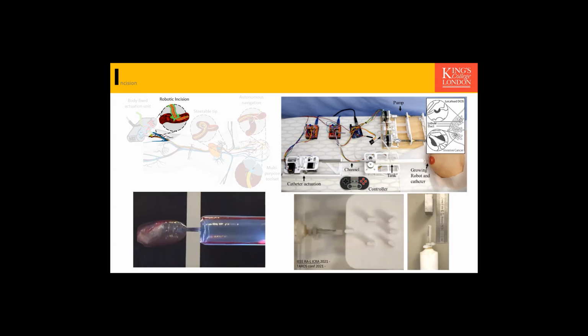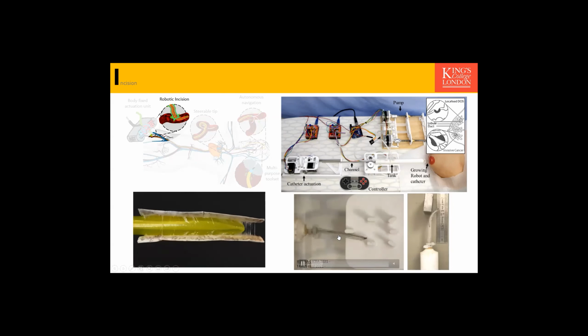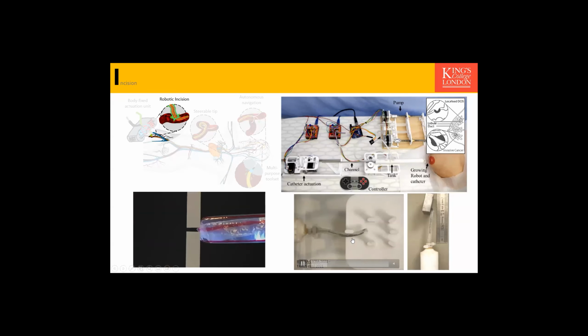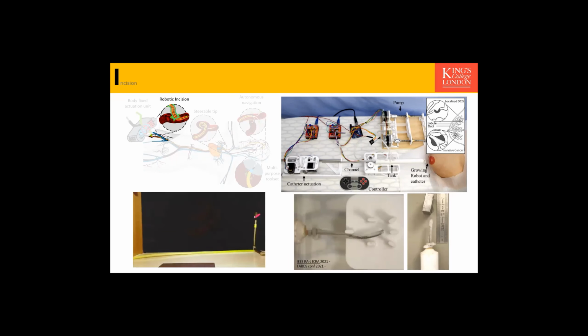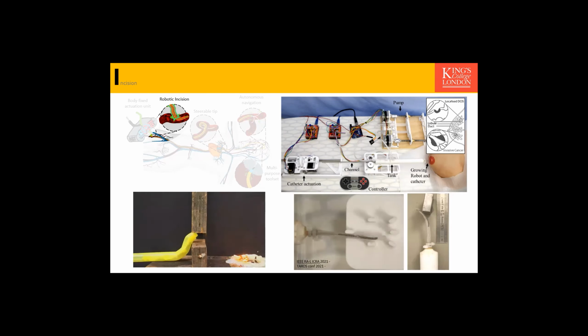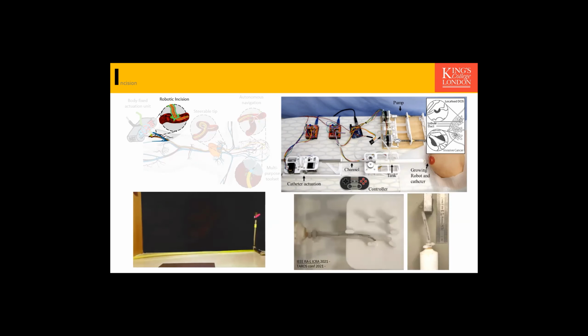Being miniature, we had a lot of issues for effective growing of the robot. You see the inner catheter, which is a tendon-driven catheter, needs to push in and out to promote the growth of the sheath. But overall, we have effective growth and steering. Fantastic job by Pierre. He has a company in France at the moment pursuing the same idea, and we have talented PhD student visitors at our lab continuing the same research.